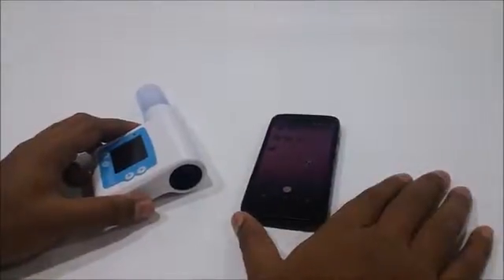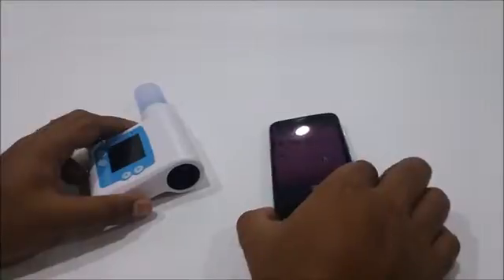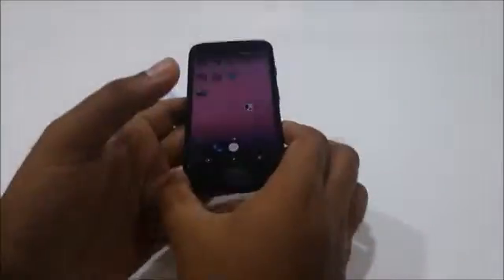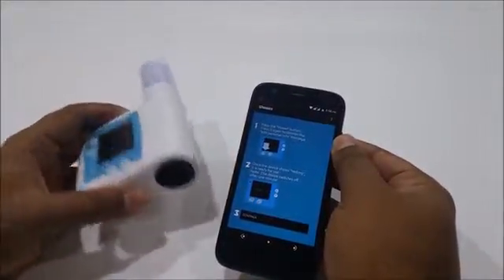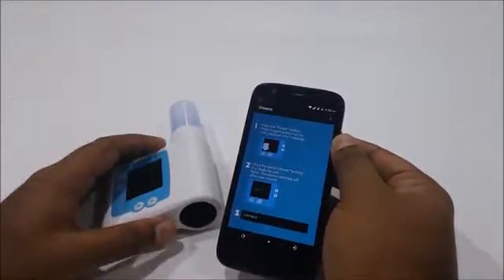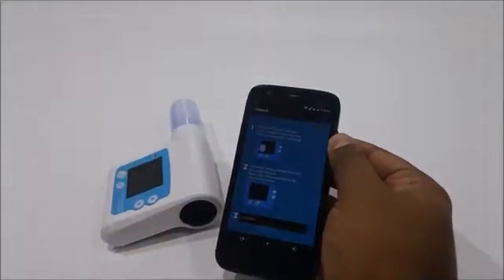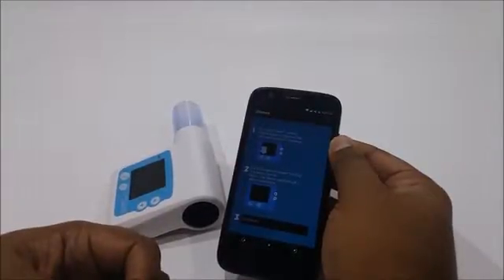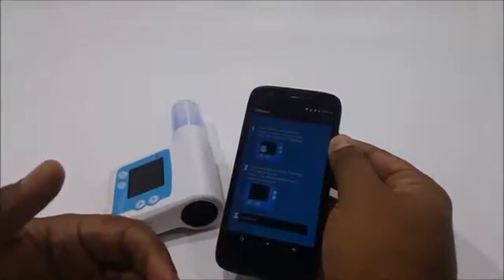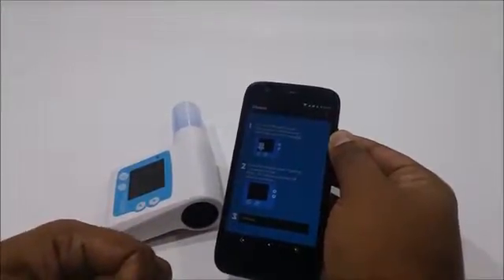Hi everyone, we are here to show you our latest product which is a spirometry app and a device. The product is called Shwas, which is Hindi for breath. It's basically an app that allows you to check somebody's breathing. It can be used at home, or in a secondary or primary care setting to look at how people are doing in terms of their respiratory health.